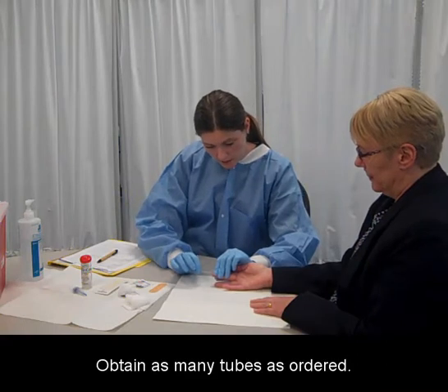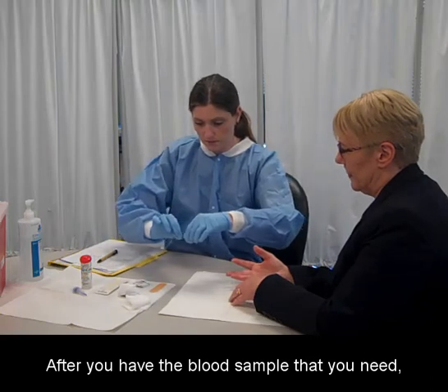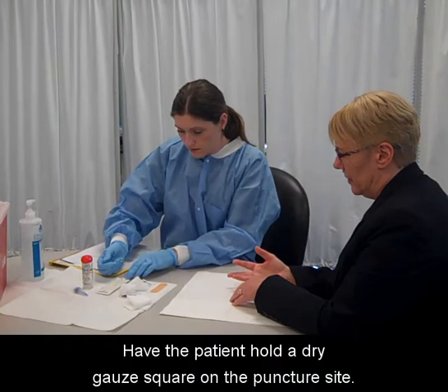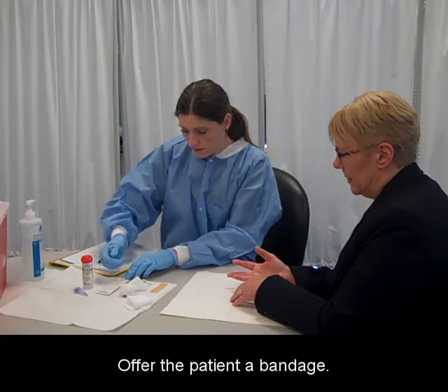Obtain as many tubes as ordered. After you have the blood sample that you need, wipe the outside end of the glass tube with a gauze square while still holding it horizontally. Have the patient hold a dry gauze square on the puncture site. Make sure bleeding has stopped, then offer the patient a bandage.